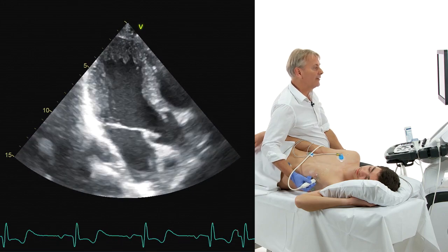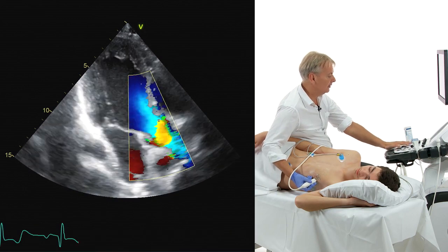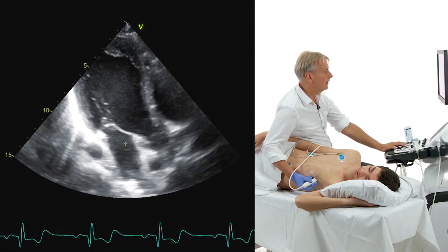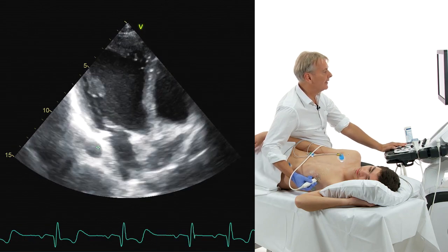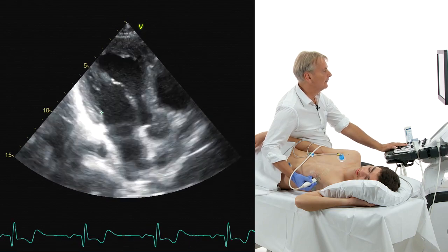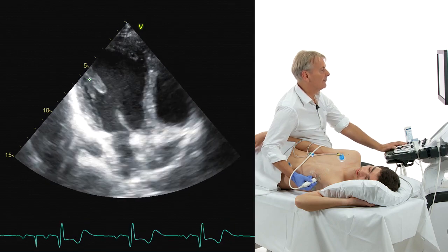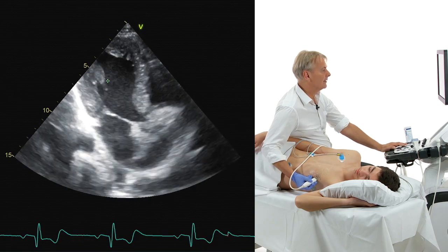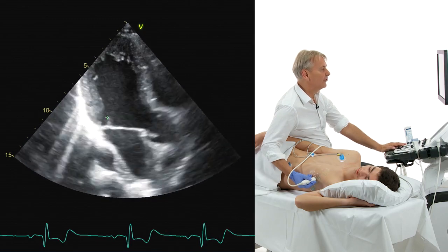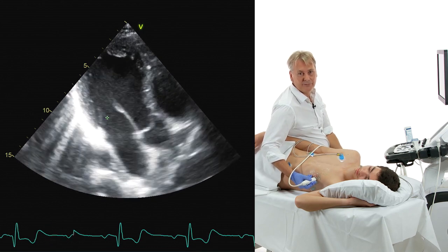Now let's take a look at what we actually see in the three-chamber view. As already mentioned, we have the aortic valve right here with the flow across the aortic valve. We have the LVOT. This here is the left atrium. Right back here we have the descending aorta, and we have the posterior leaflet and the anterior leaflet with the chordal structures, the subvalvular apparatus, and the papillary muscles. So this is a view which is very good to assess, for example, mitral regurgitation and restriction of the leaflets. But this will come later when we talk about the mitral valve.